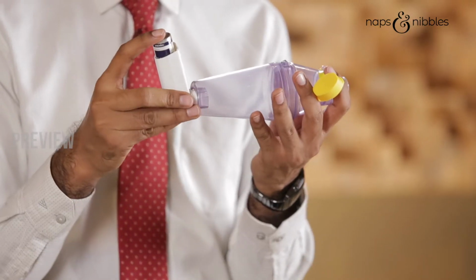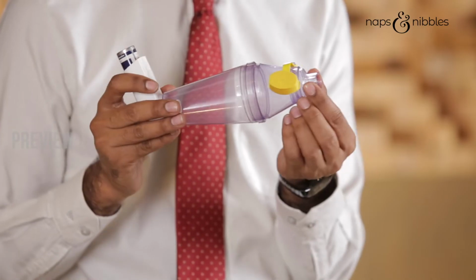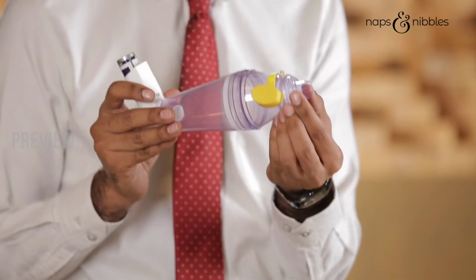Next, you insert the inhaler firmly to the opposite end of the spacer. Before giving the first dose, ensure that the child breathes fully out. Then, remove the mouthpiece cap from the spacer and see that the child closes his lip firmly around the mouthpiece to create a good seal.